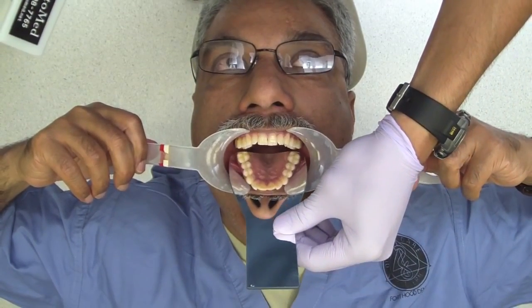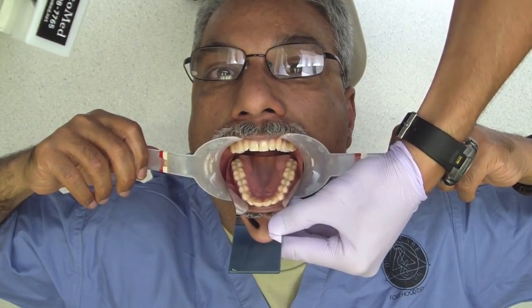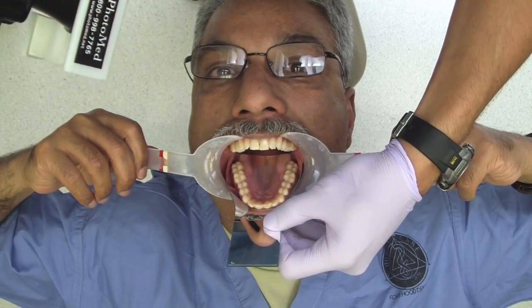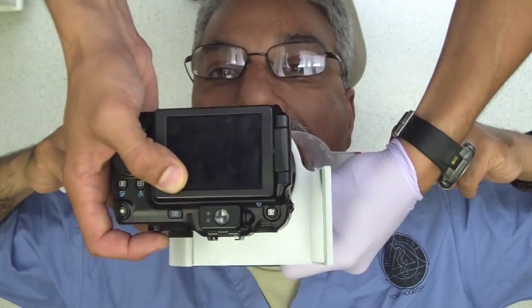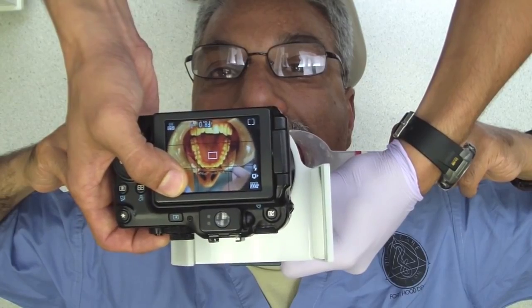There we go. Just open for me. So I'm just going to slide this. Just keep your head normal. There we go. So you can see now things we're looking for. Don't go quick on this. Now because it's heated, I have a little bit of time, so I'm trying to make sure I have the right angulation. And with this camera, it's going to be different with every other camera. That's the shot that I'm looking for. You can zoom in, obviously.